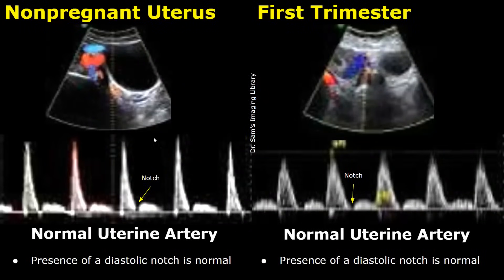Hello everyone, this is Dr. Sam, and this video is about uterine artery Doppler ultrasound. These are spectral Doppler waveforms of the uterine artery. The image on the left shows the spectral Doppler waveform of the uterine artery in a non-gravid uterus. It consists of a high resistance waveform with a sharp systolic peak. An early diastolic notch is usually seen — this groove right here is the notch. This is normal in a non-gravid uterus.